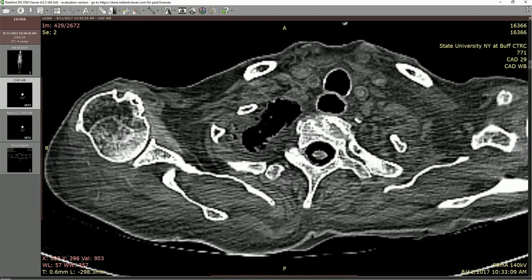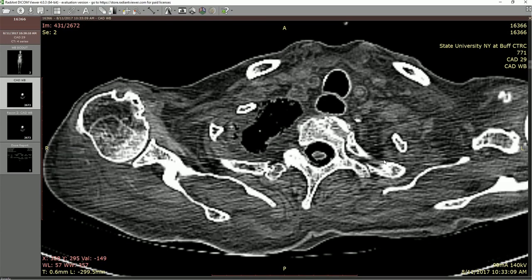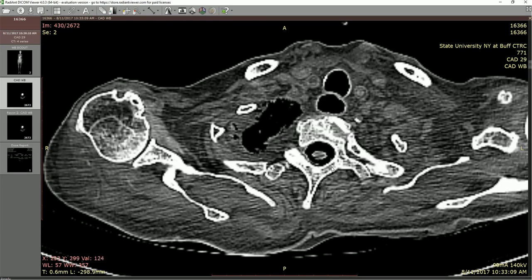Moving more centrally, we can see that we're in the thoracic vertebrae because we have our first couple of ribs. Here is a rib — we can see the head of the rib articulating with the facets on the body of the vertebrae. And this would be the articulation between the tubercle of the rib and the transverse process of the vertebrae as well.